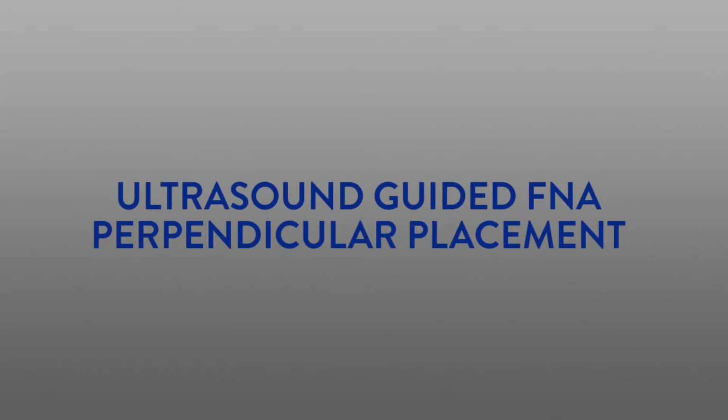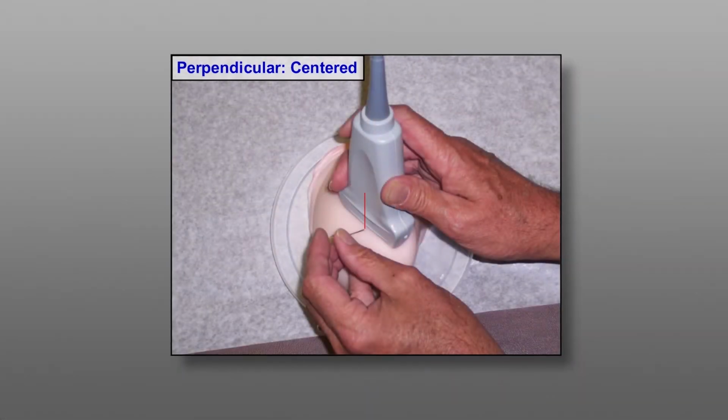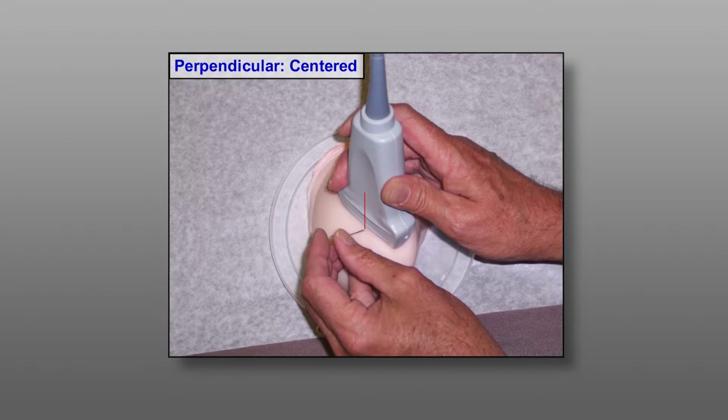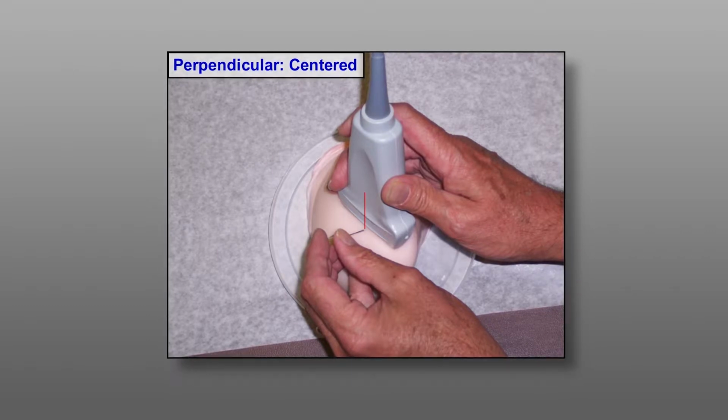Perpendicular needle placement. Center the probe directly on top of the target. Check the distance from the skin to the target in order to judge the appropriate needle angle to use.